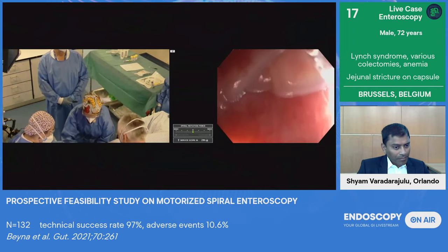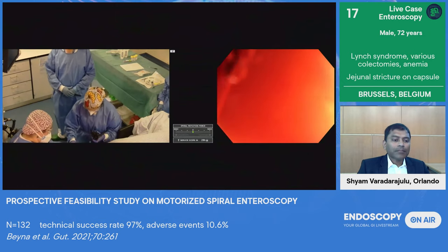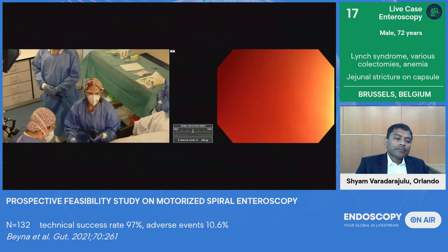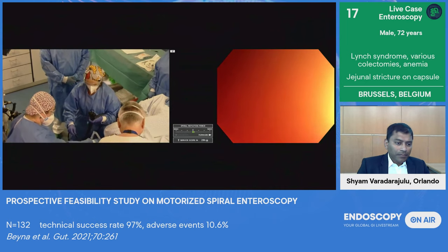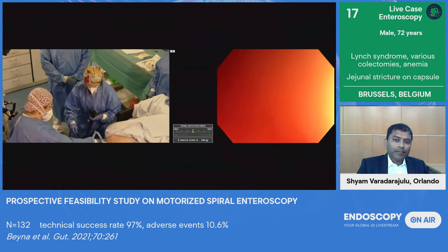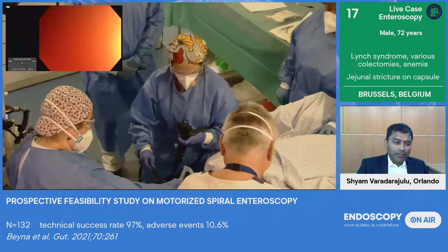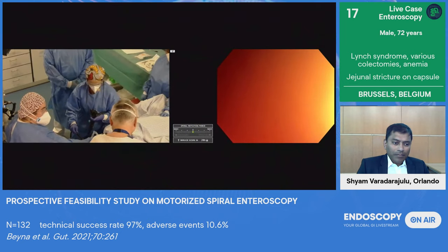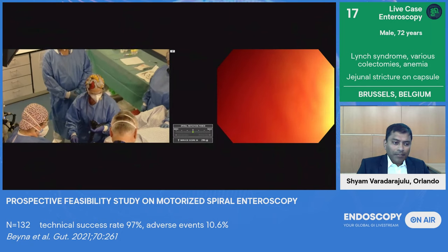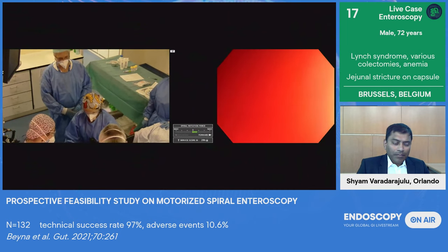And then we'll start putting gel for the introduction, and we'll put a bit of upper extension. And I will ask Michelle to deflate the tube. So the purpose of deflating the tube is mainly to limit the resistance against the tracheal balloon. And now Mariana will apply the torque forward.